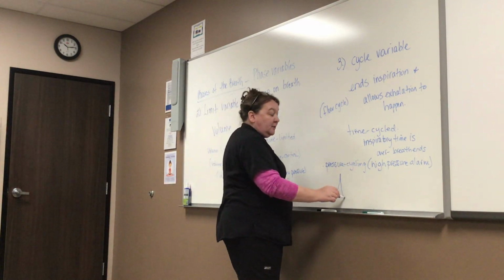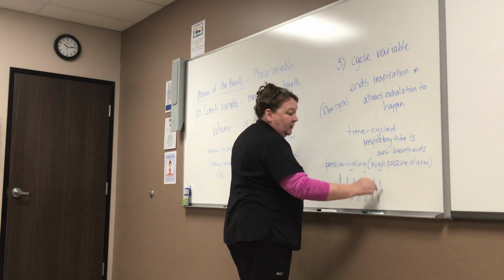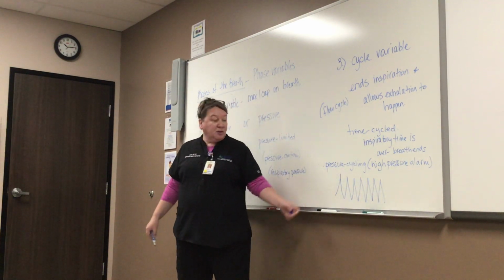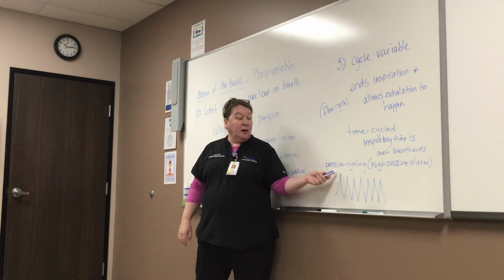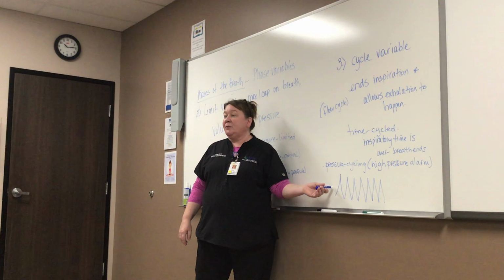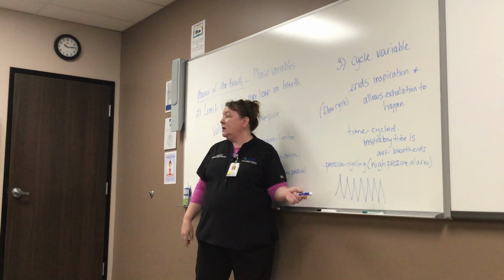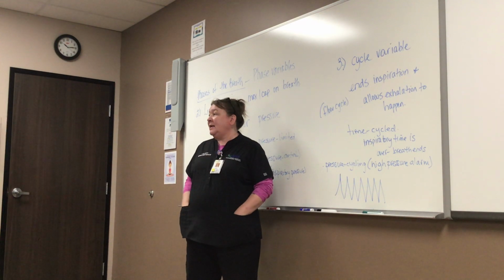So pressure cycling looks like this. Up, down, up, down, up, down. Is your patient ventilating if this is happening? No. The breath is going up, stop, up, stop, up, stop, up, stop. That's what you would see if you had like a mucus plug. So if they're pressure cycling, they're not gonna have any E time. They're not gonna have anything. It's just gonna continue to do this.